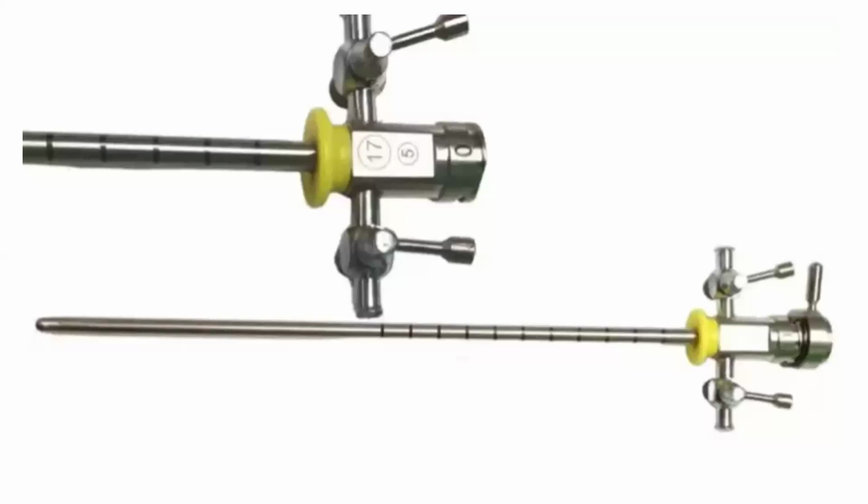So identification of the instruments, name of the instrument if it is there, description of the instrument, then the material from which it is made. The next will be sterilization, and then the uses. Okay? Yes, sir. 17 French cystoscope sheath, sir.